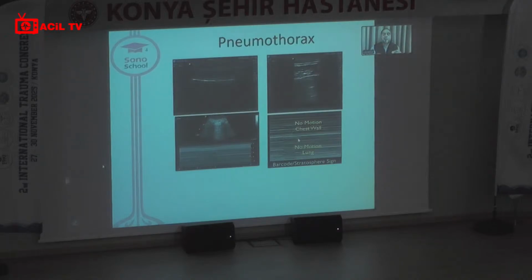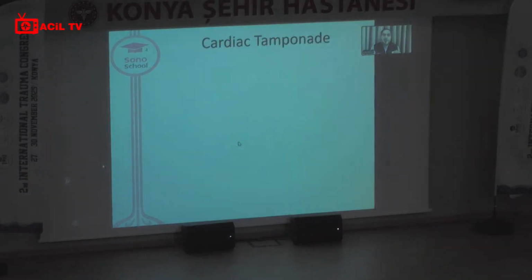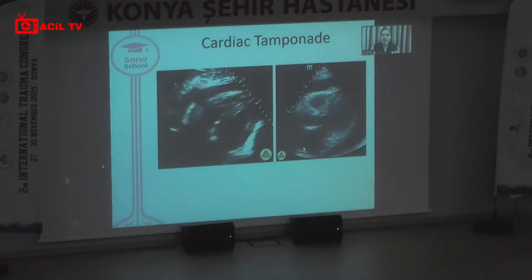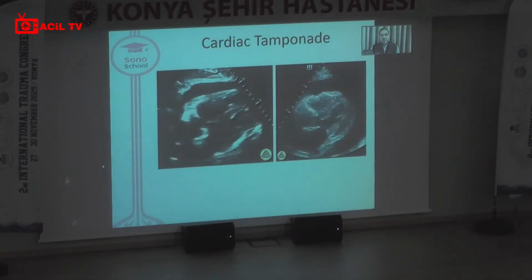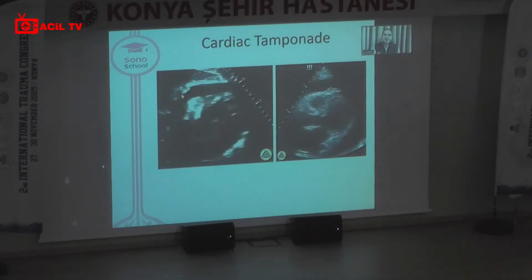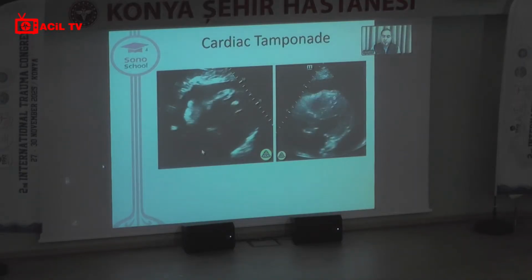In M-mode, you can see the barcode sign and the absent lung pulsation. If you suspect that the patient has massive chest trauma and cardiac tamponade, in the subxiphoid view, you can put your probe and see any collection around the heart.